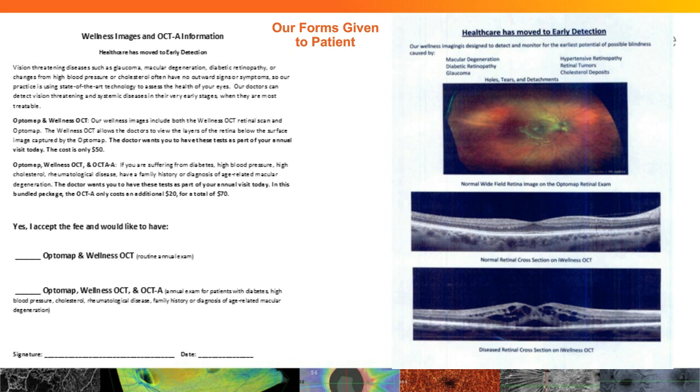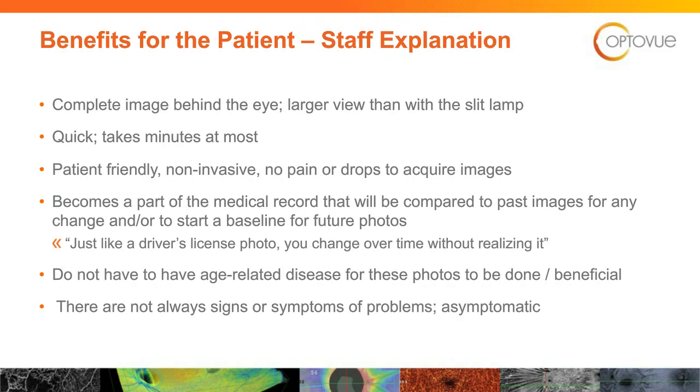So it benefits the patient to have the staff explain. It's a complete image behind the eye. It's a larger view than the slit lamp. It's quick; it takes minutes at most to acquire it. It's patient friendly, again non-invasive, with no pain or drops required for these images. It becomes part of your medical record that will be compared to past images in looking for changes.